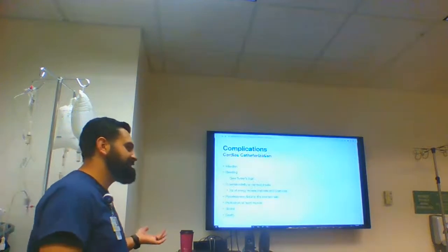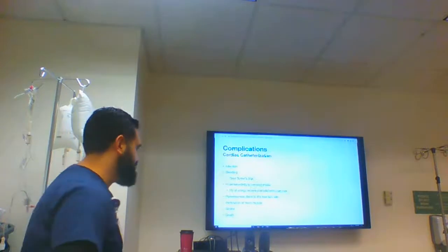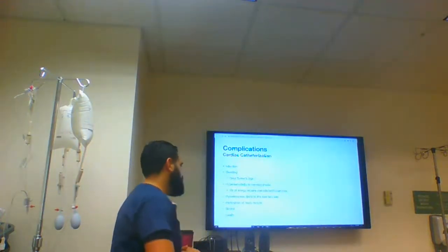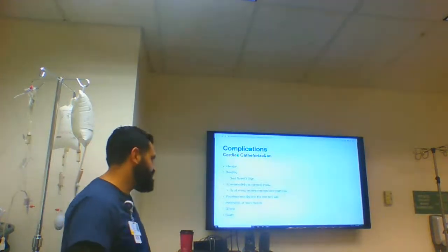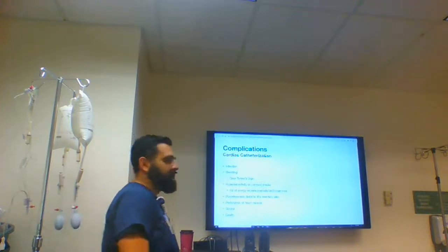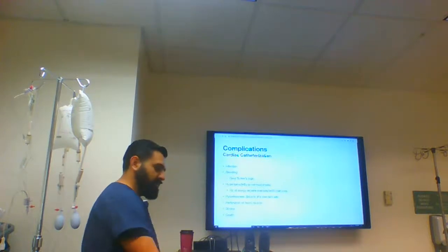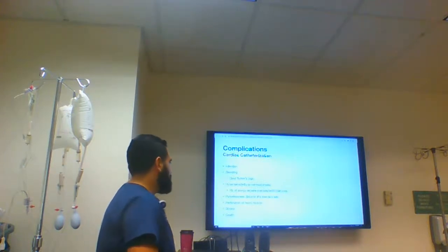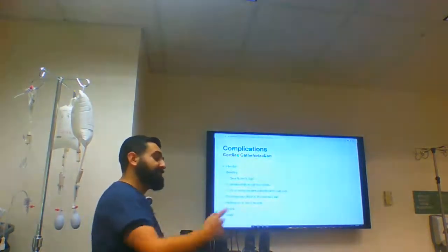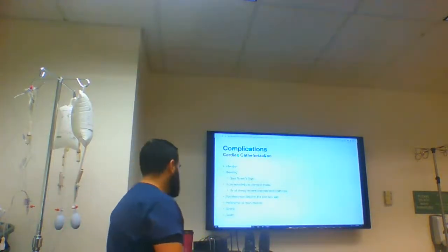If you have an allergy to contrast media, like I said before, you're going to receive steroids, antihistamines. It doesn't mean you get disqualified from getting the cardiac cath. And then pulses distal to the insertion site. Not so common, but kind of common when you have a bigger sheath, like an Impella. That's very important. Distally, you have flow. Of course, perforation of heart muscle. They go up there, do a little oopsie, they go too far. Stroke and death, right? And this is all typically in their consent.